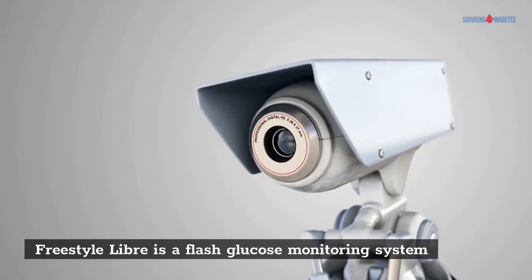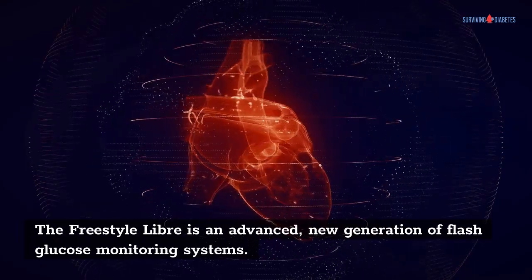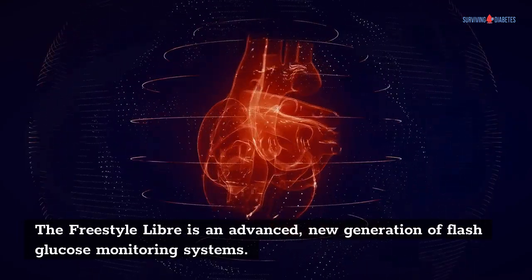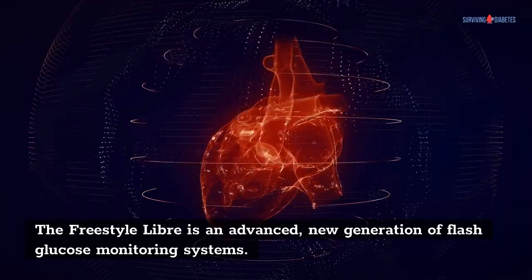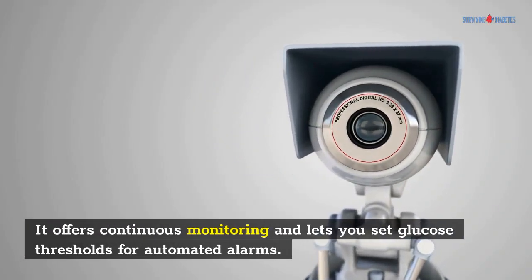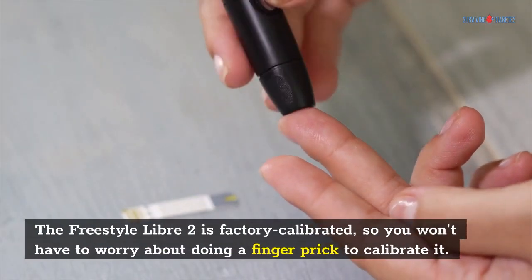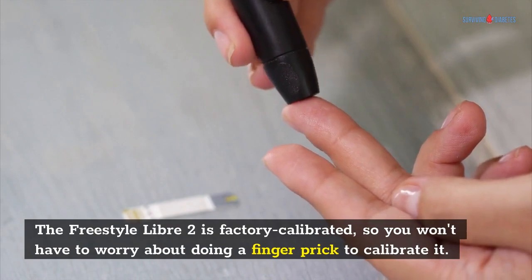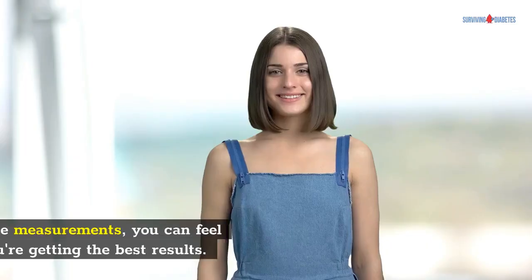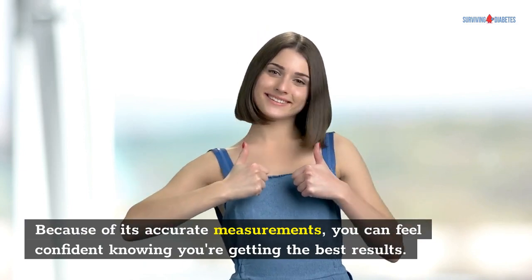Freestyle Libre is a flash glucose monitoring system — an advanced, new generation of flash glucose monitoring. It offers continuous monitoring and lets you set glucose thresholds for automated alarms. The Freestyle Libre 2 is factory calibrated, so you won't have to worry about doing a finger prick to calibrate it. Because of its accurate measurements, you can feel confident knowing you're getting the best results.